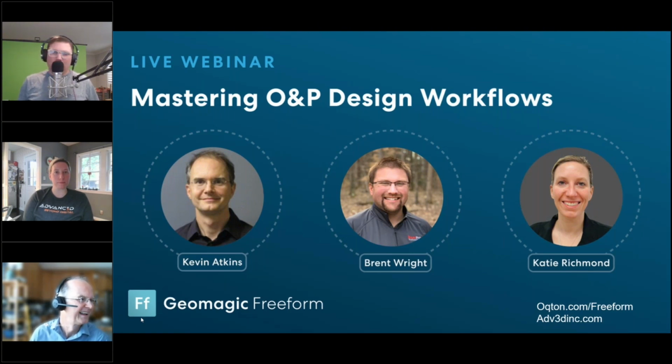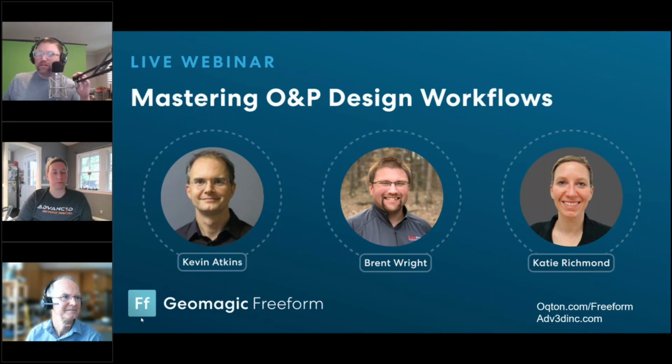Yeah. And even though I've been in it, there's so much to learn to make you better and to be more efficient. At first you start gaining hours into your efficiency, and then you start knocking off, say, 15 minutes. But now we're getting to the point where we're hopping into the weeds and asking, okay, is it Y up or Z up? Now you're saving a minute, instead of flipping things around. If you actually flip it in your original settings, then you're done. So I think those are things that are important for people to know, that you can set it up the way that you want it.